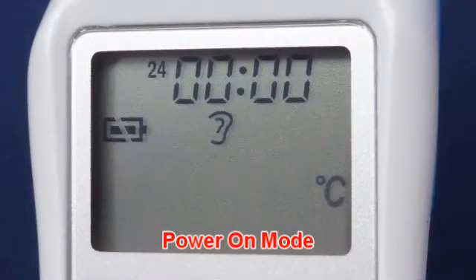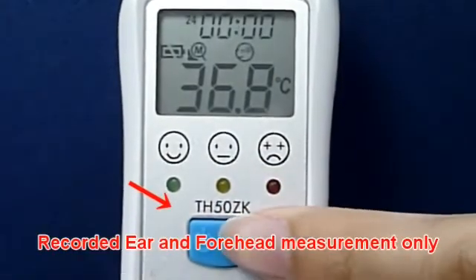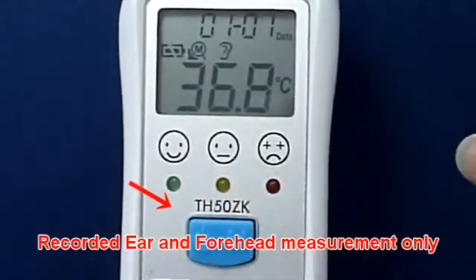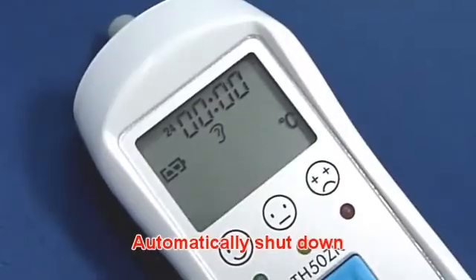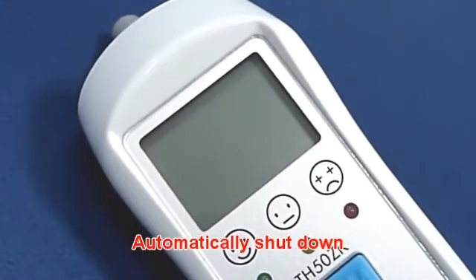In Power On Mode: if the temperature is within the normal range, this thermometer records the last measurement data before power off. Press the On Memory Button to see the temperature records. The device will automatically shut down after one minute to extend battery life.